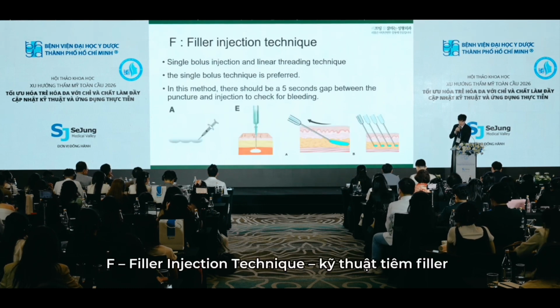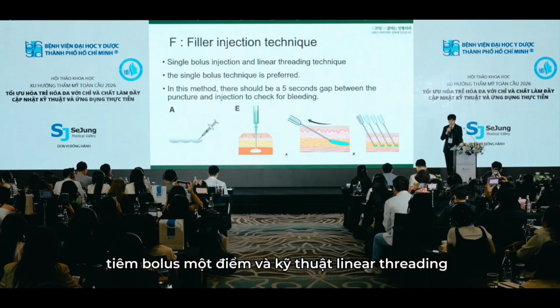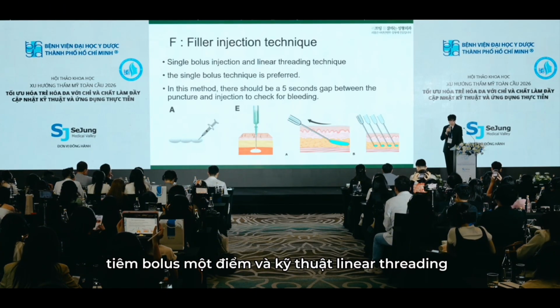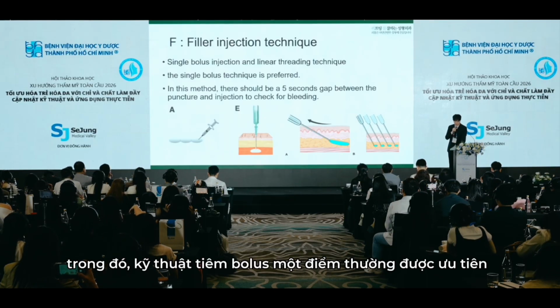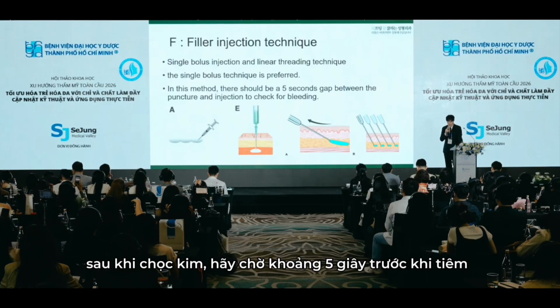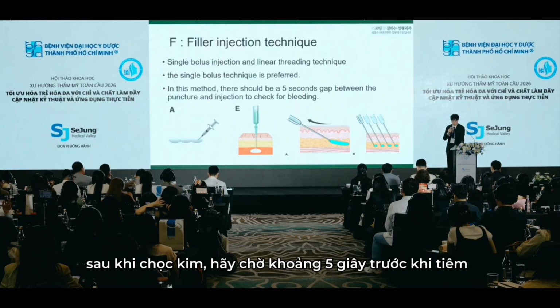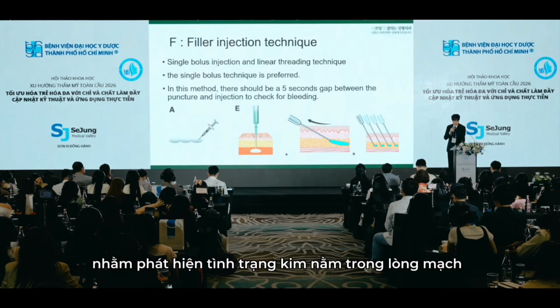F, filler injection technique. There are two main techniques: single bolus injection and linear threading. Among these, the single bolus injection technique is generally preferred. After puncturing, wait approximately 5 seconds before injecting to check for any bleeding, which helps identify intravascular placement.